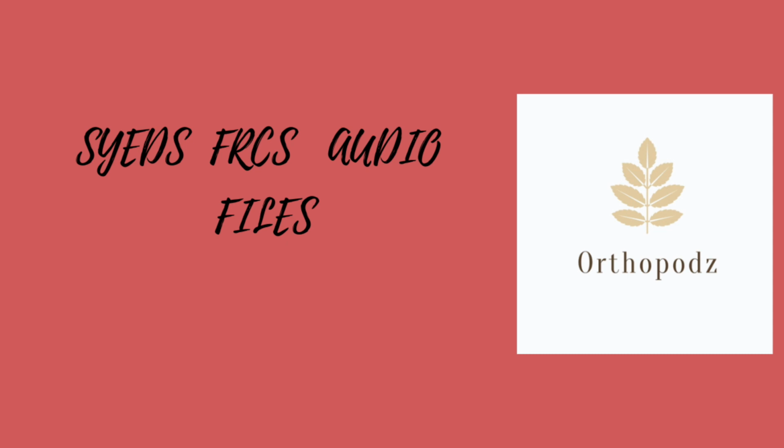PET-CT, positron emission tomography, is a form of radionuclide scanning. Biochemical or metabolic activity can be overlaid over the CT scan, known as a co-registered image. Contrast: barium can be given orally, iodinated can be given IV, and iodinated plus FDG, fluorodeoxyglucose, is also possible to be given.